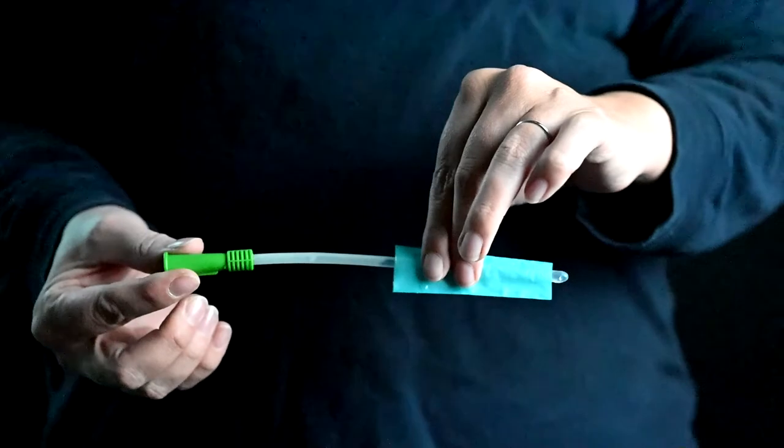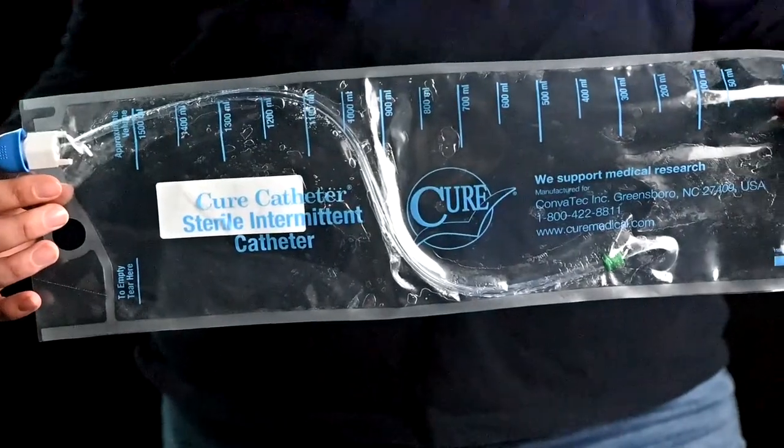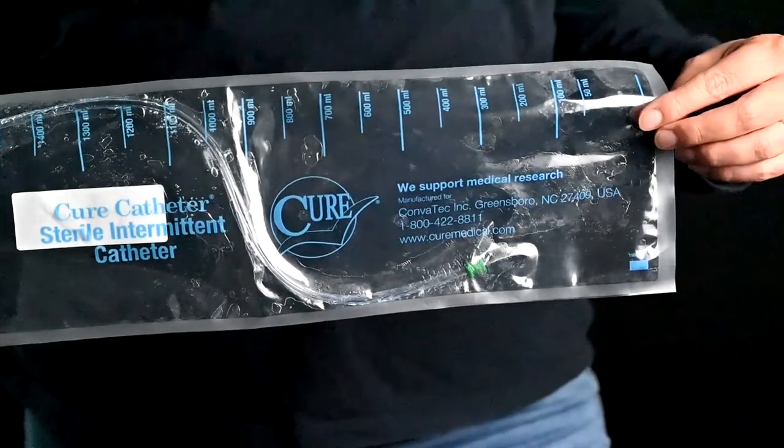A no-touch catheter is a catheter that gives you the option to catheterize without actually having to touch the catheter directly. That could be anything from an insertion sleeve, which a lot of our hydrophilic catheters do have now, to a touch-free catheter with an insertion tip where you're able to enter that catheter and catheterize directly into a bag without ever having to touch the actual catheter itself. It makes for a much cleaner insertion and lowers your risk of infection.